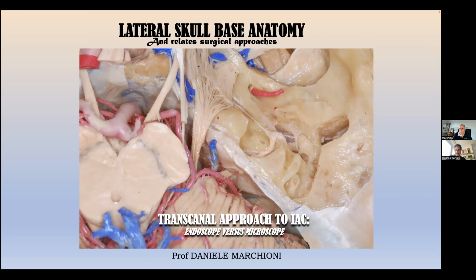The position of the facial nerve is deep with respect to the tumor in this approach. For example, in the middle fossa, the first thing that you meet is the facial nerve. And in the translab, you can understand better because the facial nerve is under the superior vestibular nerve. So we can follow the facial nerve. In this approach, the facial nerve is the deepest nerve. So normally you can just pull the tumor gently and it will come with you. Yes, dissecting the capsule of the tumor, of course, in a soft way, respecting the deepest part of the internal auditory canal.